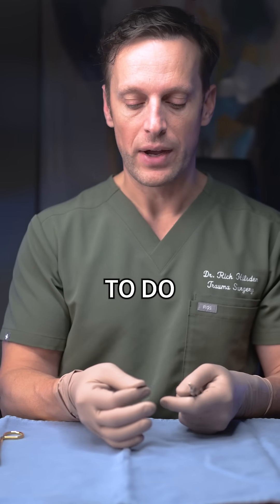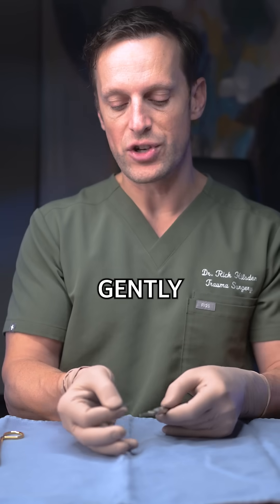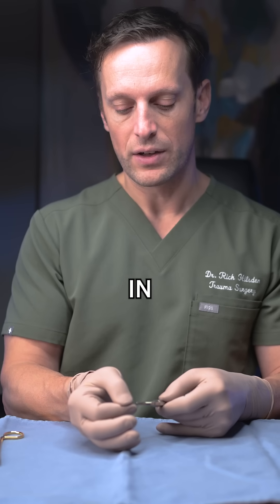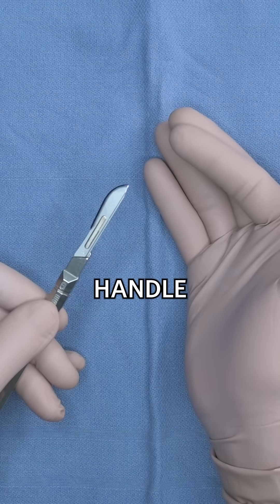That's something we have to do, and you can see the blade is nowhere near my skin the way I'm holding it. I just gently fit the fenestrated groove in with the keyhole of the scalpel blade, and very gently pass it on to my scalpel handle.